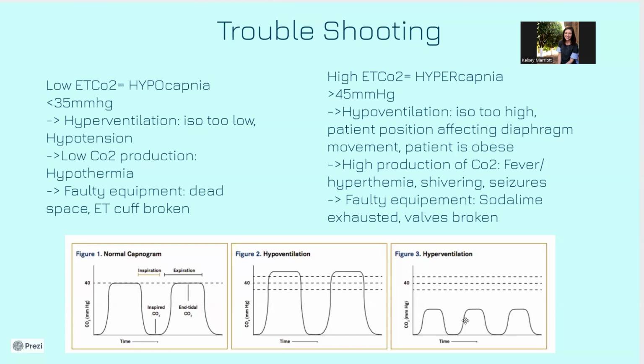This could be occurring for a couple of things. It could be because our ISO is way too low and we could be hypotensive. We can also be seeing this due to dead space. A lot of times when we intubate, we might be having too much excess.